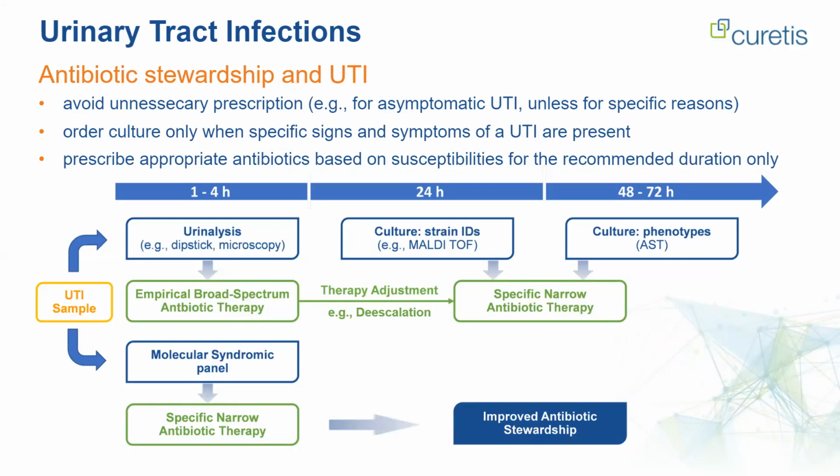Of course, there are also considerations about the potential challenge in result interpretation and the cost. So it will be important to integrate the molecular panel carefully into the current workflow, combining it with traditional culture to ensure that they support each other and can be used for an appropriate and effective routine test. Thank you.